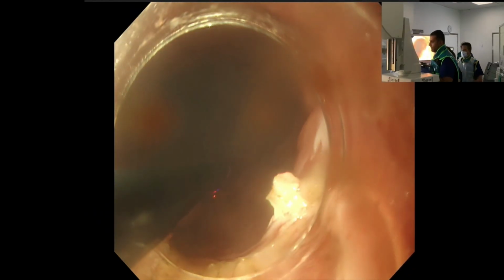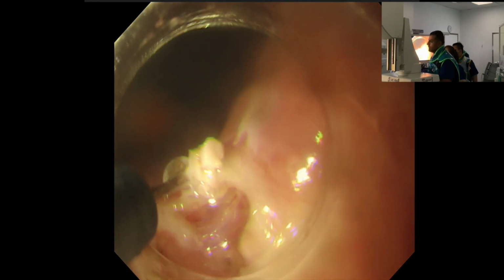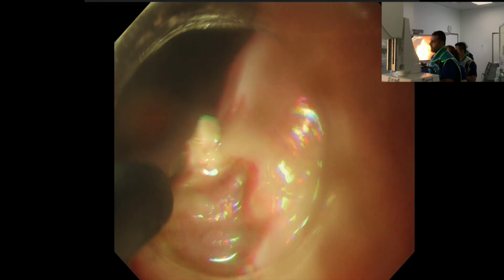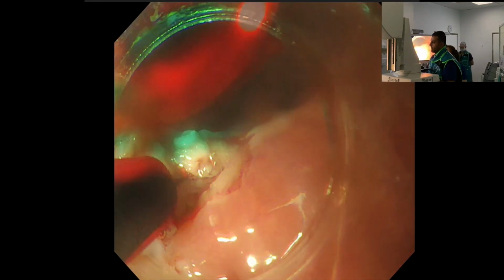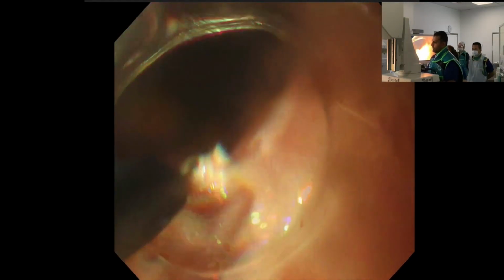Yes, knife out, please. Thank you. Just want to pivot my knife into that ridge and then get a bit of downward pressure from the endoscope this way around 360 degrees. There we go. That's exactly the bit that I wanted.